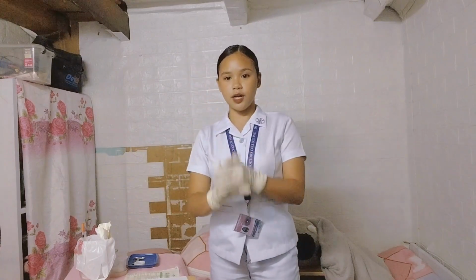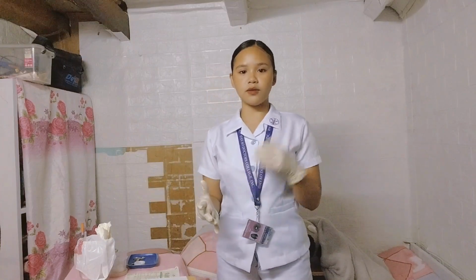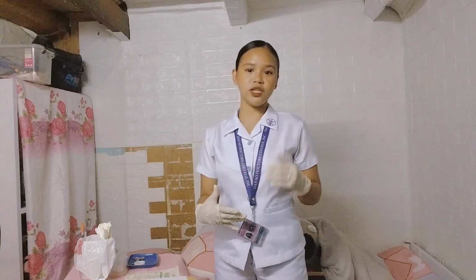After that, do the aftercare of equipment, remove the gloves, and of course perform hand hygiene. After the whole procedure, document all relevant information. Many agencies prefer that medication administration be recorded in the medical record.